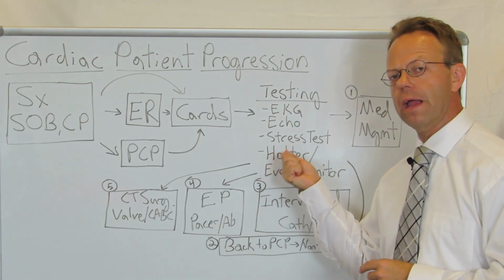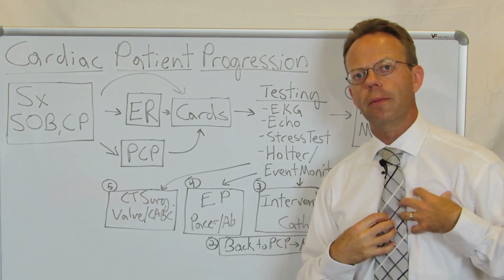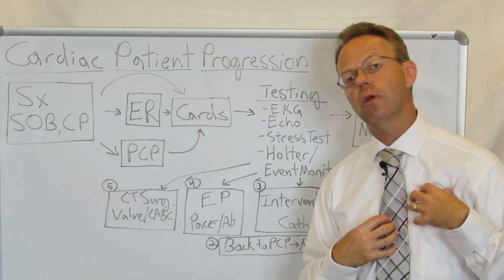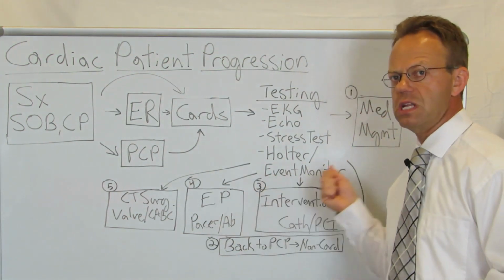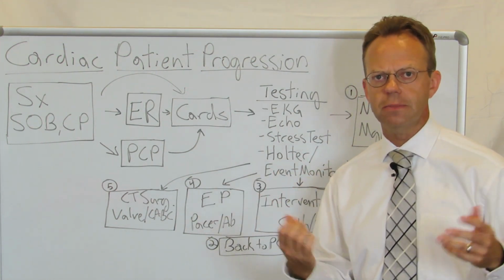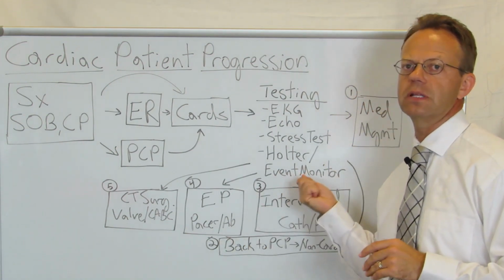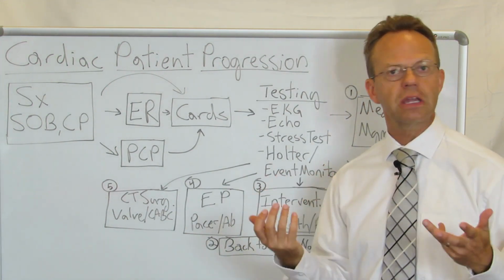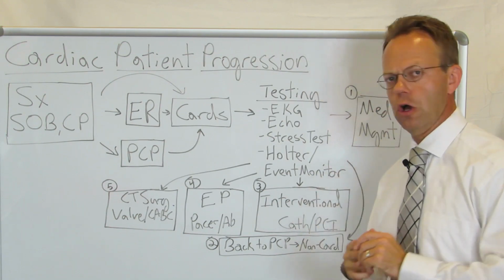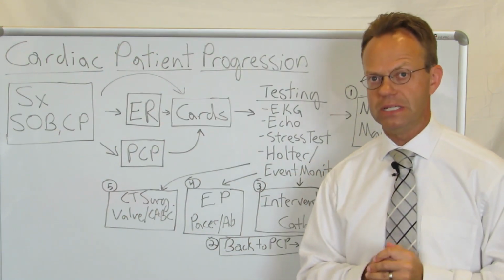So they're all over the map in terms of how much they cost. Or also a Holter monitor, or what's referred to as an event monitor. So a Holter monitor will monitor the heart's rhythm and rate for about 24 hours, whereas an event monitor is when a person feels a palpitation or some sort of symptom, they'll actually be able to push a button or hold it up to their chest, and it typically is done over the course of several days or even a week, and that is to diagnose various types of arrhythmias or irregular heartbeats.